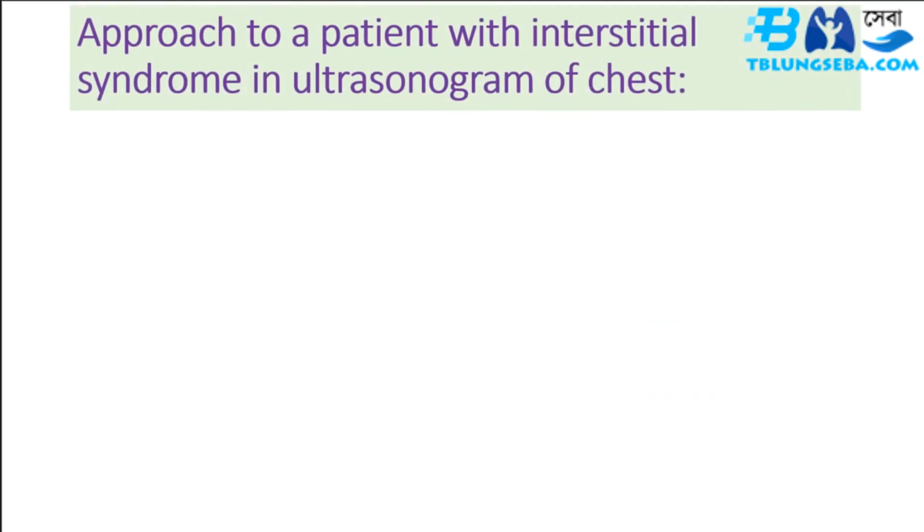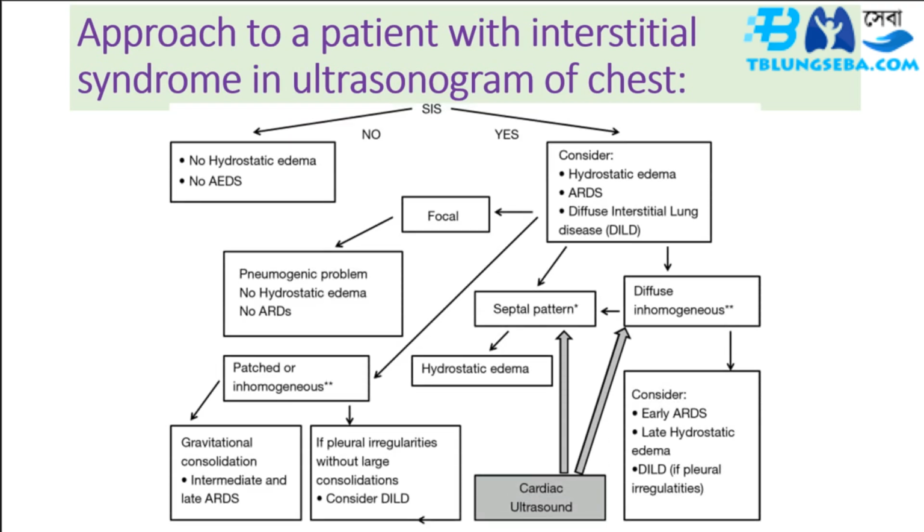Approach to a patient with interstitial syndrome in ultrasonogram of chest. No hydrostatic edema. No ARDS. Pneumogenic problem. No hydrostatic edema. No ARDS. Focal: consider hydrostatic edema, ARDS. Diffuse interstitial lung disease, DILD. Septal pattern: hydrostatic edema. Patched or inhomogeneous.